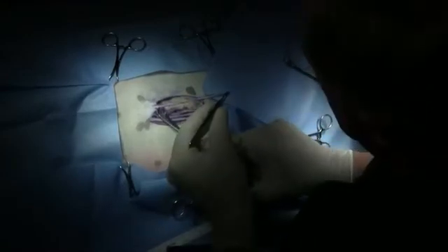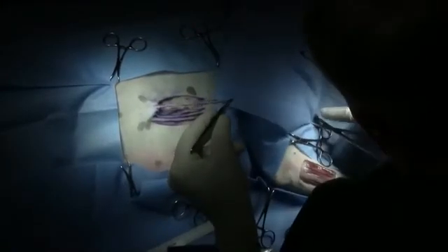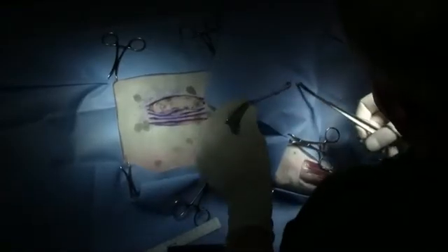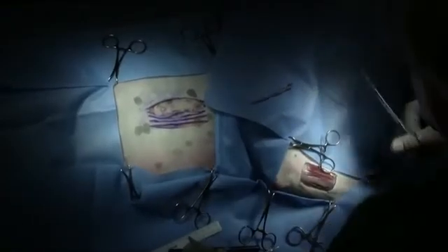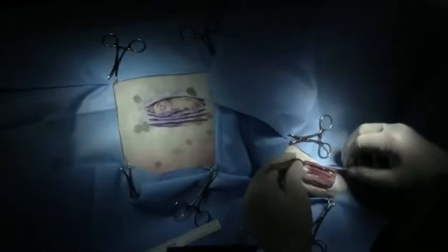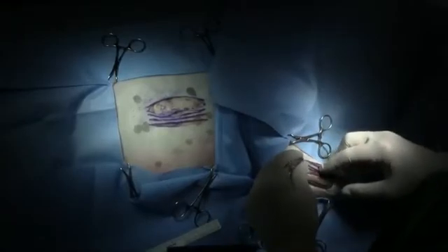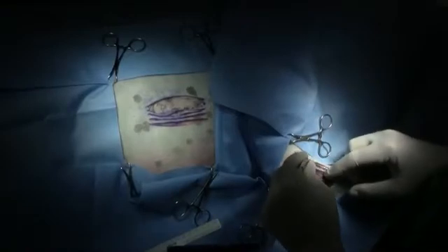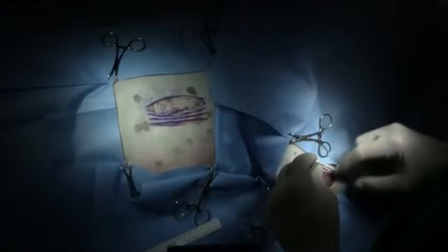We'll come back here and cut that free — and there's our graft. That's our first strip graft. We'll take that graft now and take it up to our area where we're going to place it in a groove. We'll find that groove that we've created and place that graft down in that groove, as we have shown here.